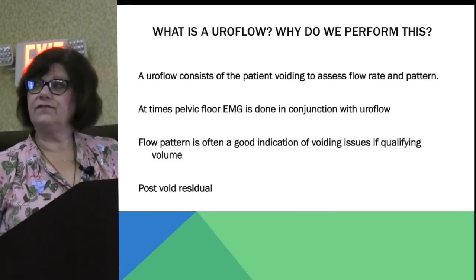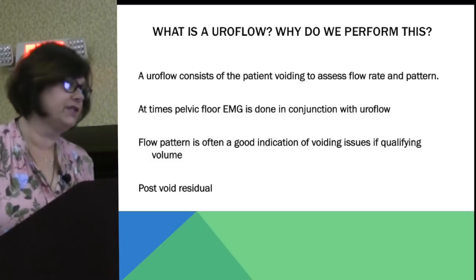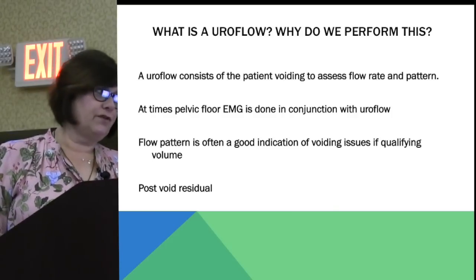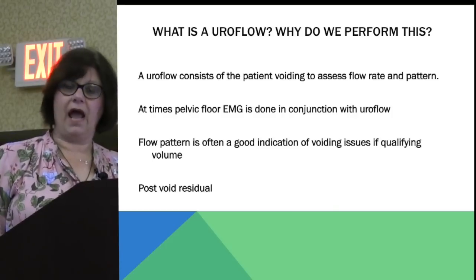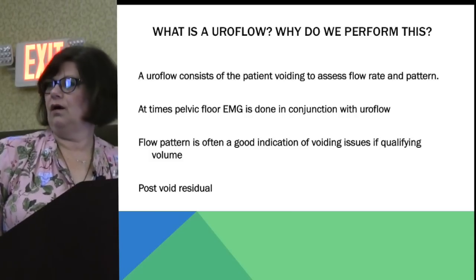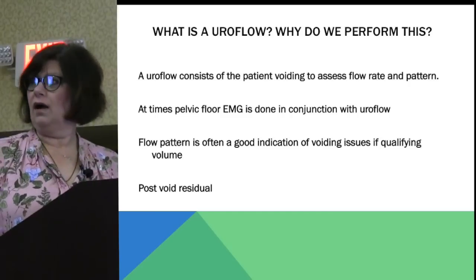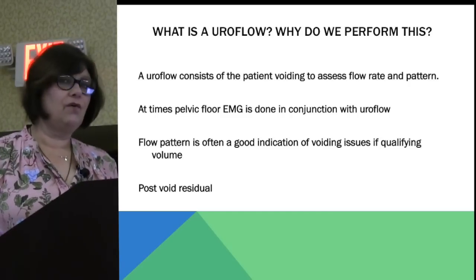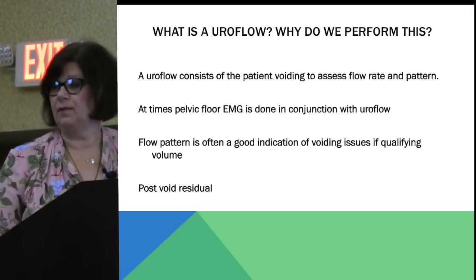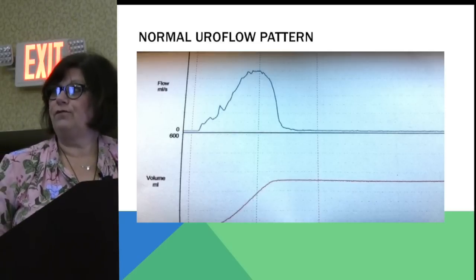And then the flow pattern itself is a great indication of voiding issues, and you'll get a little bit more information on that as you go into the rest of your testing. But a flow pattern can show you whether someone has suspected BPH or, again, a very tight pelvic floor. And then after we do the uroflow, we measure a post-void residual to see how well the patient empties their bladder.